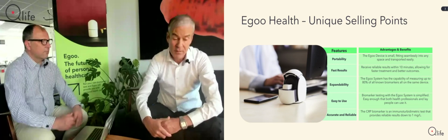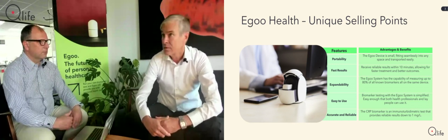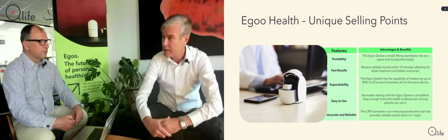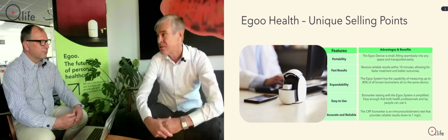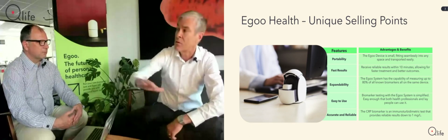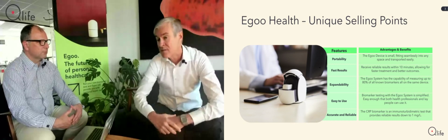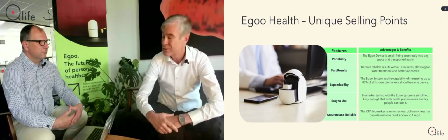That means that if your CRP level is high, maybe your doctor wants to adjust so that you get more of the biological drug. And if it's low, maybe you can get a little bit less. So in that case, it's directly correlated. But in other cases, it's just an indicator of basically how you are doing. If you monitor your inflammation level over a longer period of time and the trend is going up, it means that your disease, your pain is basically going the wrong way. And if the trend is going down, it means that you're doing better.